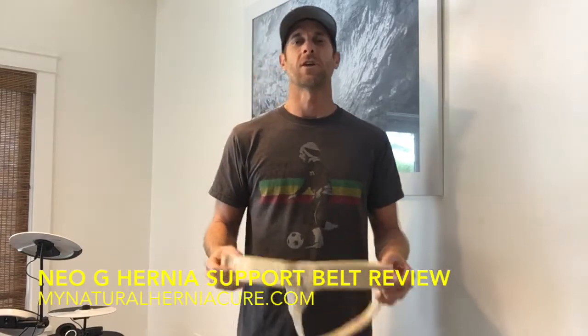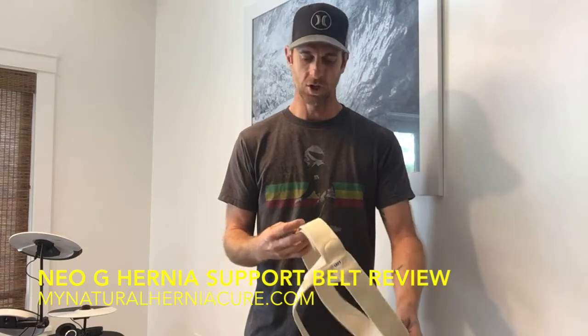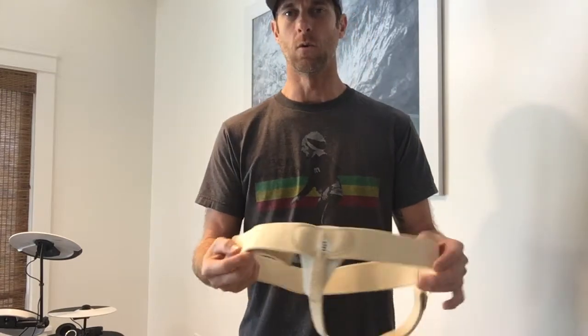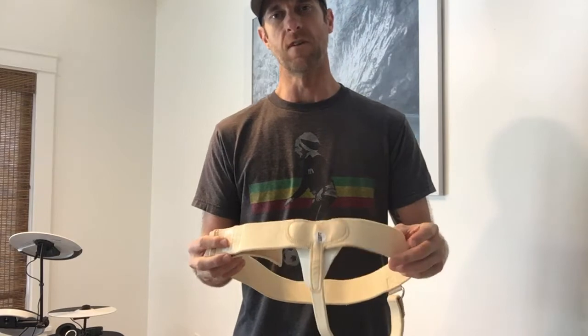Hey guys, George here from MyNaturalHerniaCare.com with another hernia belt review. This time I'm going to be doing the NEO-G hernia support belt. This one you can get in left, right, or both sides — they sell it all three ways — and these are about $35 online.